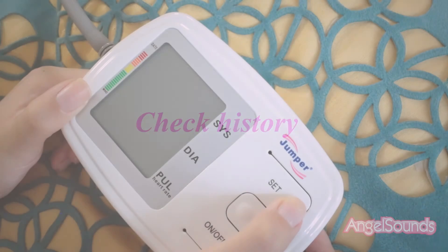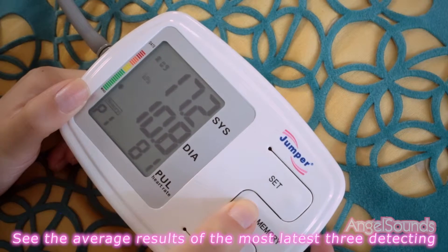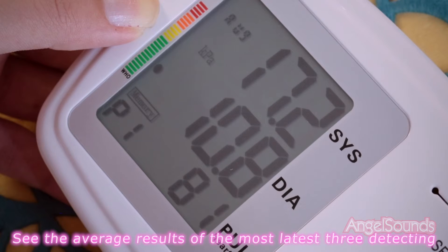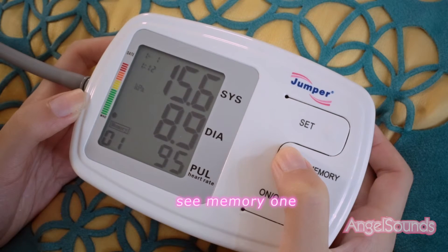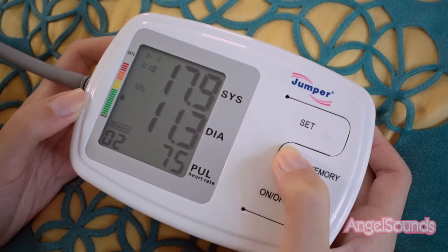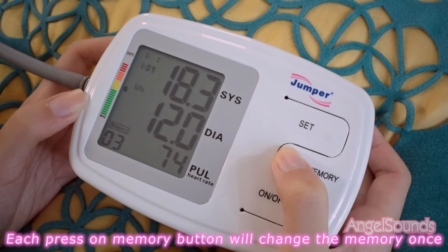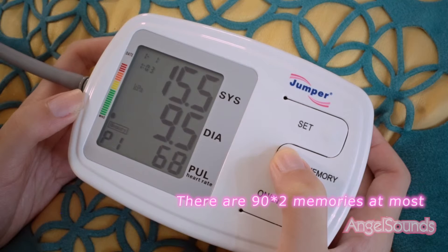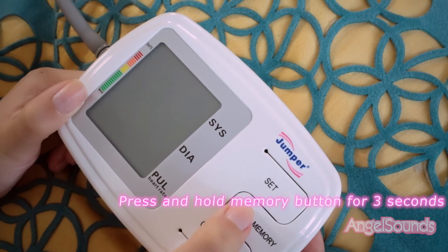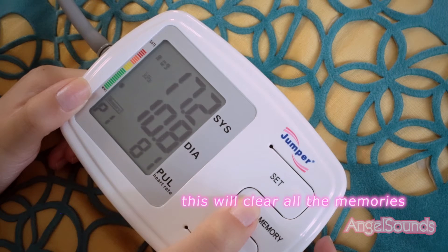To check history, when the device is powered off, press the memory button once to see the average results of the most recent three readings. Press memory once again to see memory one. Each press on the memory button will advance through stored memories. There are 90 memories stored for each of two users at most. Press and hold the memory button for three seconds to clear all memories.